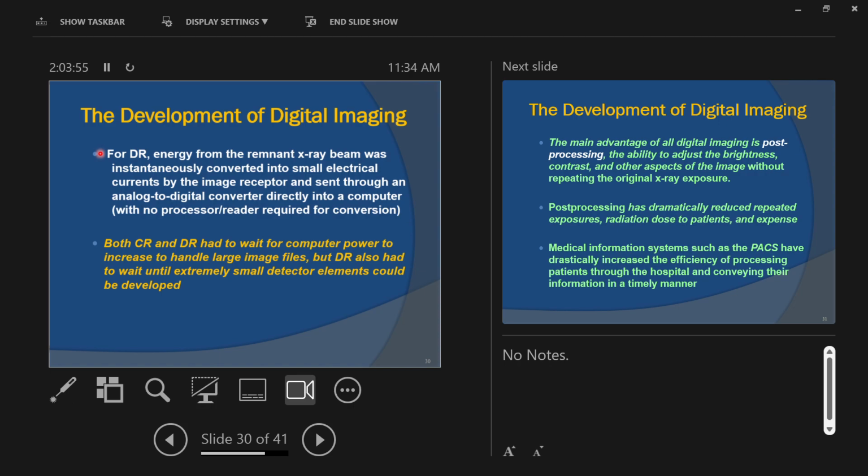Now, right here, that stuff coming out of the patient, okay, that has the primary radiation has interacted with the patient and is now coming out of the patient, the beam exiting the backside of the patient, let's say. That is called the remnant beam, or remnant radiation, okay?